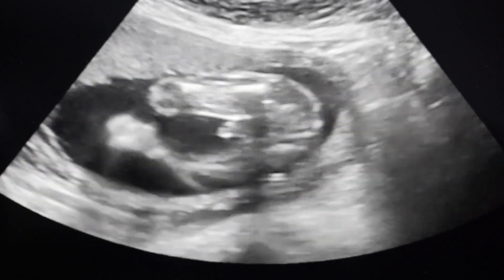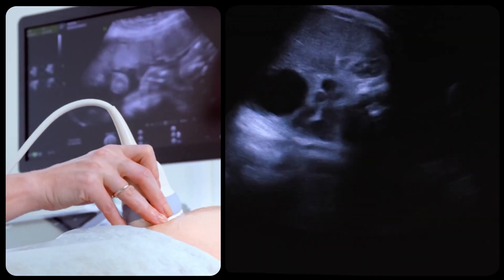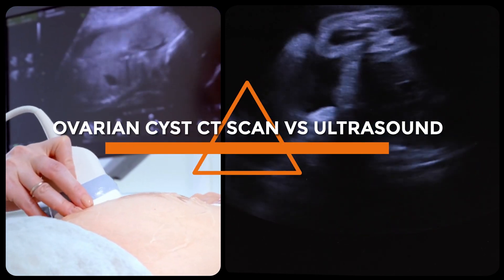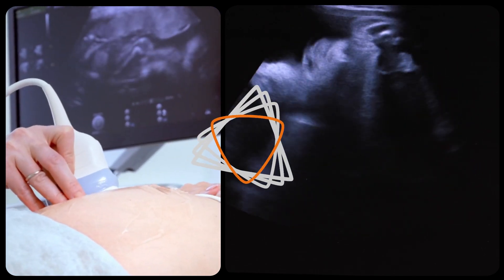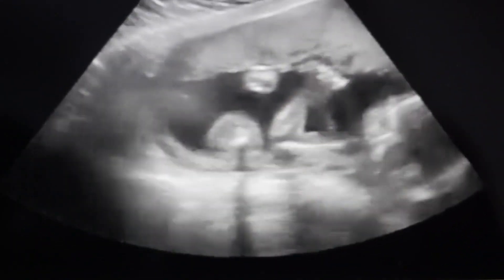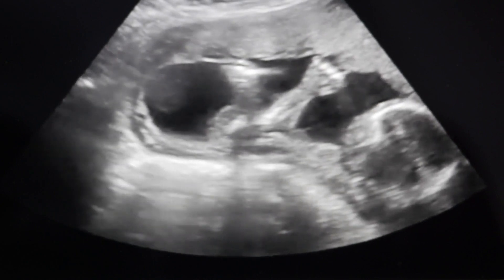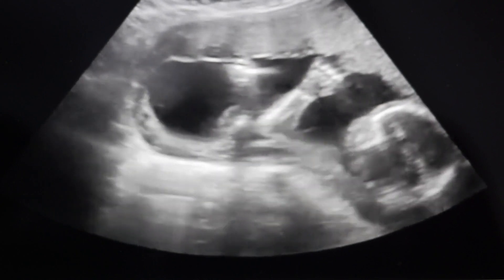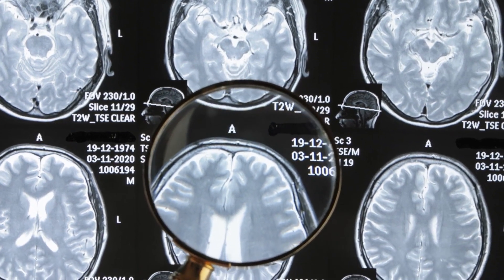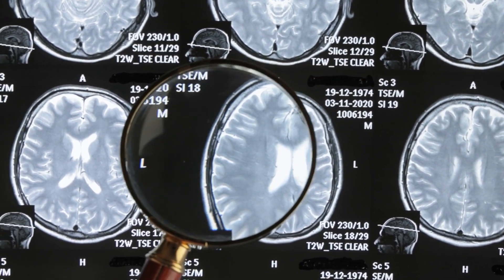Welcome to our comparison video. Today, we are delving into the world of ovarian cysts and exploring the comparison between CT scans and ultrasounds for their detection and diagnosis. Ovarian cysts are fluid-filled sacs that can develop within or on the surface of the ovaries. In this video, we'll take a closer look at the benefits, considerations, and differences between CT scans and ultrasounds in detecting and diagnosing ovarian cysts.